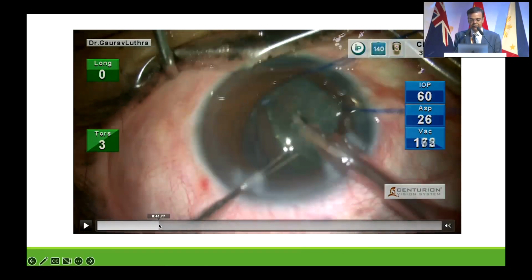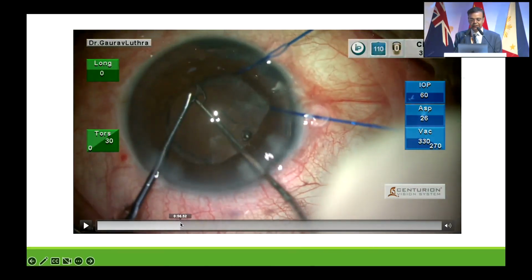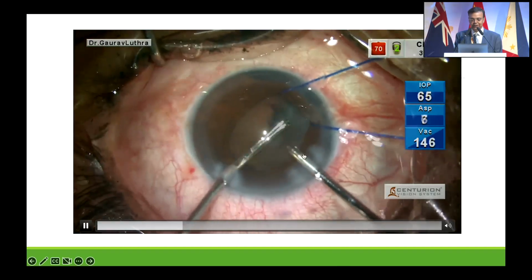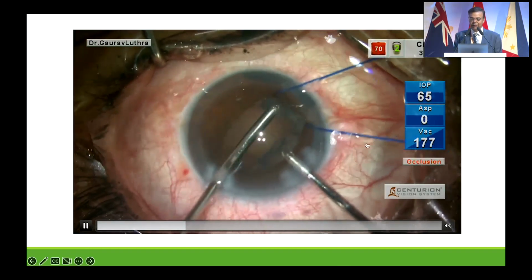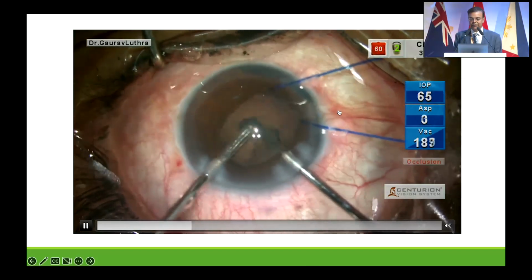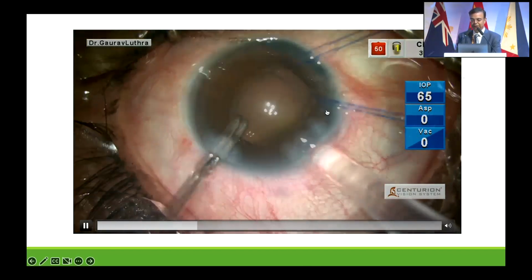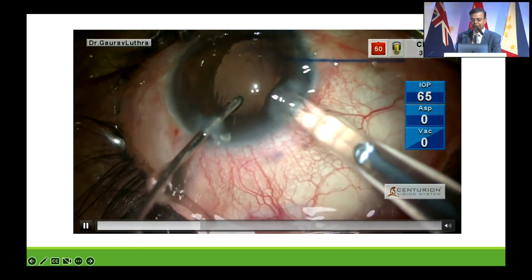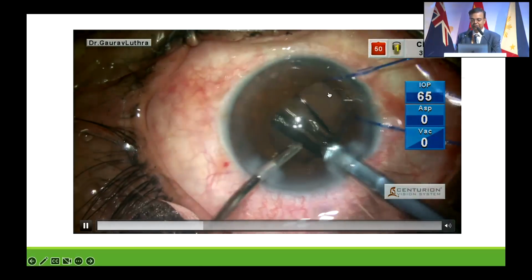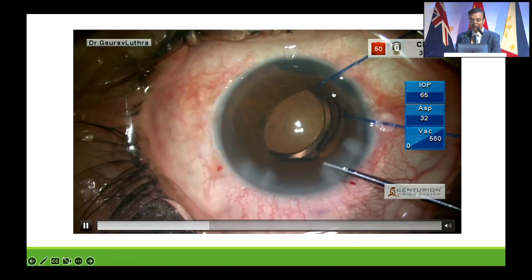So completing the rhexis and the cataract surgery, again, it's not a very hard cataract. Now this lady had previously, I put in a CTR. This lady had also had a previous pterygium excision done over here, and there was scarring of the conjunctiva. So in the area where I had to do the iridodialysis repair, the conjunctiva was not very healthy, and it was scarred on this side. So I had a situation to deal with, and we had a plan in place.